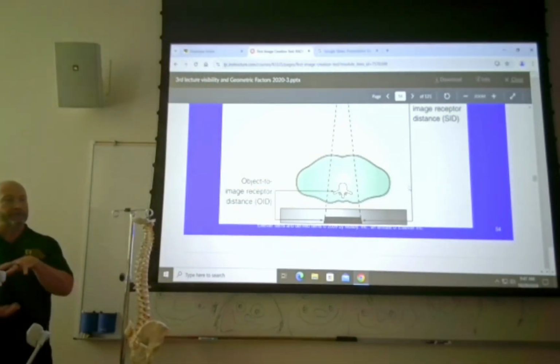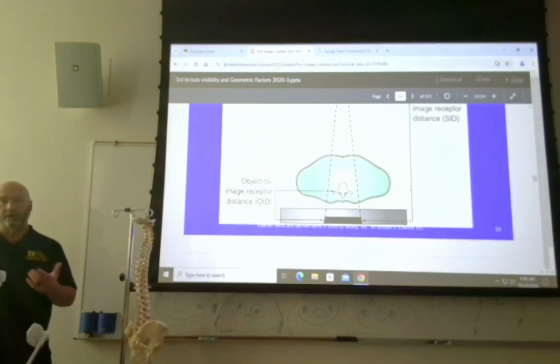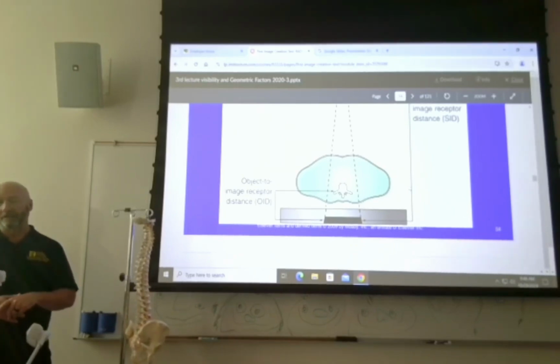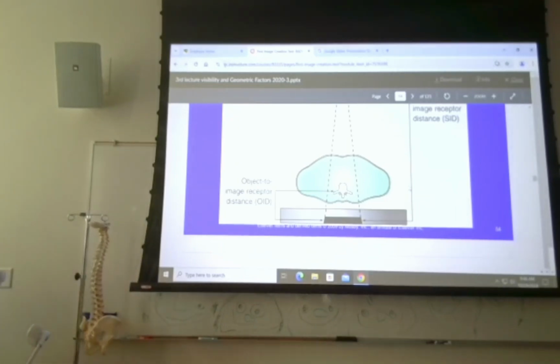Historically, with screens and films, if you increase that thickness on inhalation, what you're going to get is more scatter and you're going to reduce contrast. What's the main thing that controls your contrast now? Computer algorithm, right? So are you really seeing a loss of contrast if you shoot on inhalation? The answer is no, not really. Lose a little bit of sharpness? Well, if it's bad enough, you're probably going to see it anyway, whatever the pathology is. The abdomen's got horrible contrast anyway, you know? So if shooting on AP, shooting on inhalation rather, I wouldn't get into much of a twist about that.